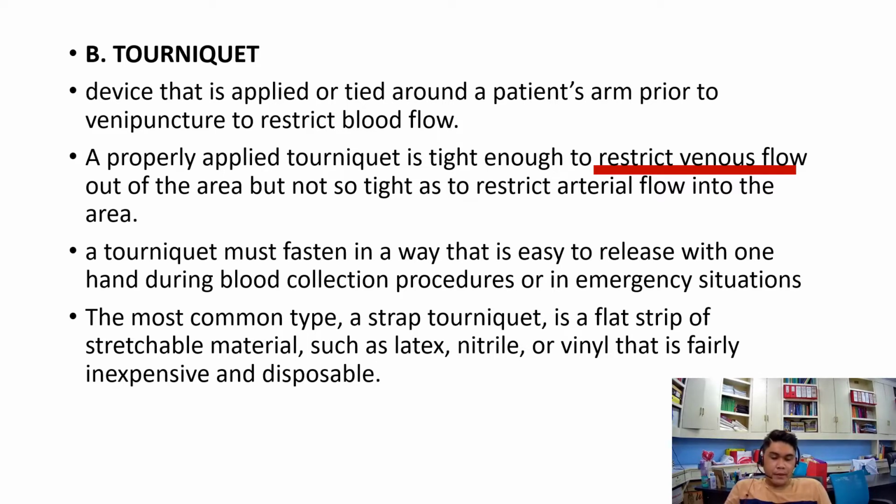Next is regarding the use of the tourniquet. You can usually reuse a tourniquet if it's not soiled or contaminated with blood, or if there's no visible contamination.